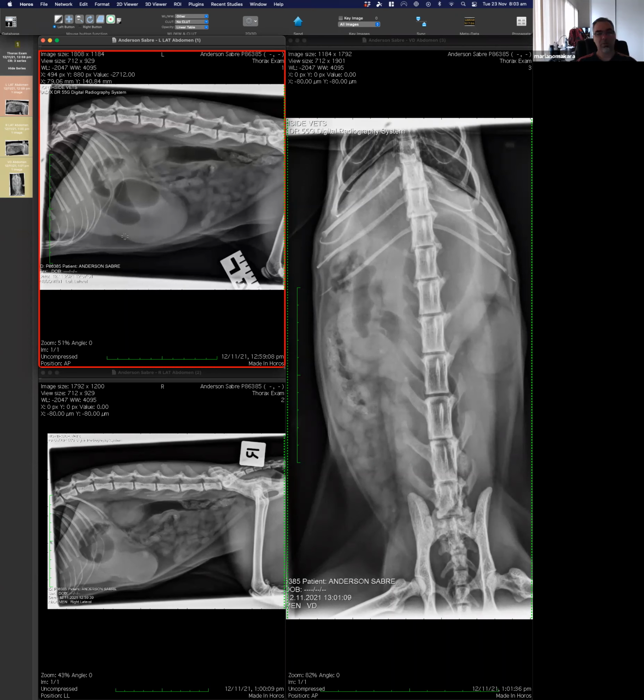People who were with me in the clinic know that my first question when someone asks for an ultrasound, in particular for a vomiting animal, is a kind of reflex: do you have radiographs? Radiographs are not something to ignore, saying it's a first line modality and then moving immediately to ultrasound. There's a lot of information we can get, and it's cheaper, faster, and can be shared. I have a feeling that sometimes we underrate them, and that's why I like this case.